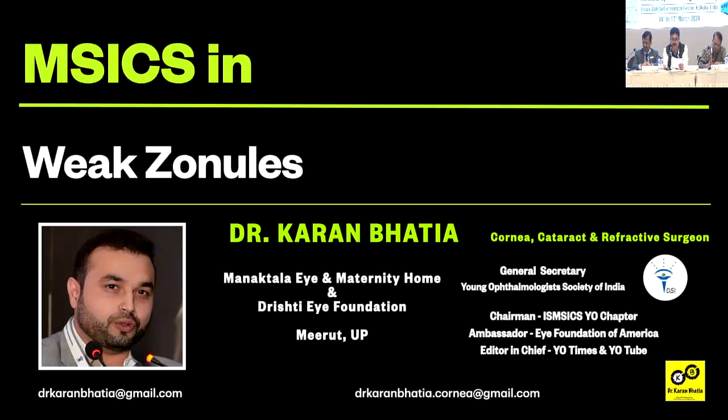Thank you very much. I've changed things a little bit because Dr. Deepak was covering the challenging cases. I just decided to focus on one aspect of it, that is the weak zonules.